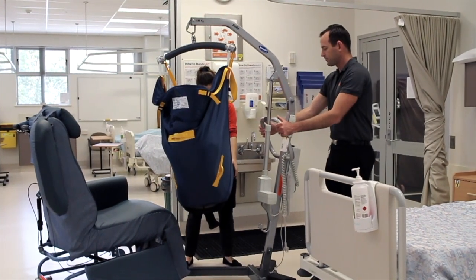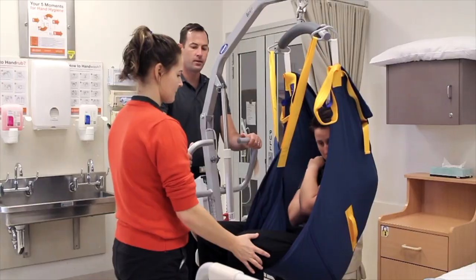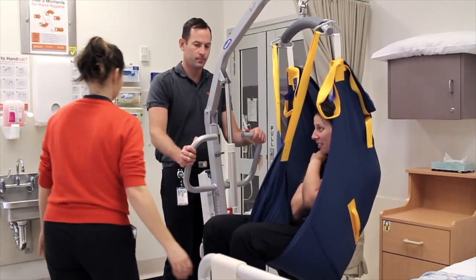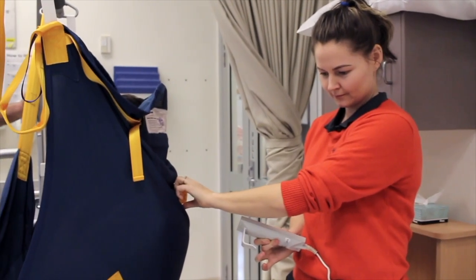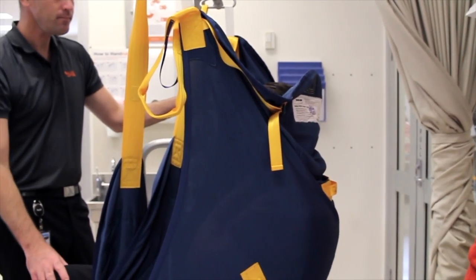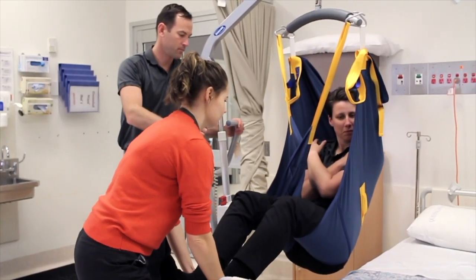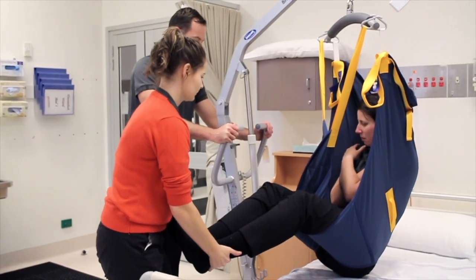One therapist is in control of manoeuvring the hoist while the other therapist or staff member is in position looking after the resident. We'll adjust the bed position to make sure that it matches as closely as possible to the resident or consumer's position — in this instance a semi-reclined or semi-seated position. As the hoist is moved in, we'll assist the client or consumer's legs up onto the bed to avoid any skin tears.